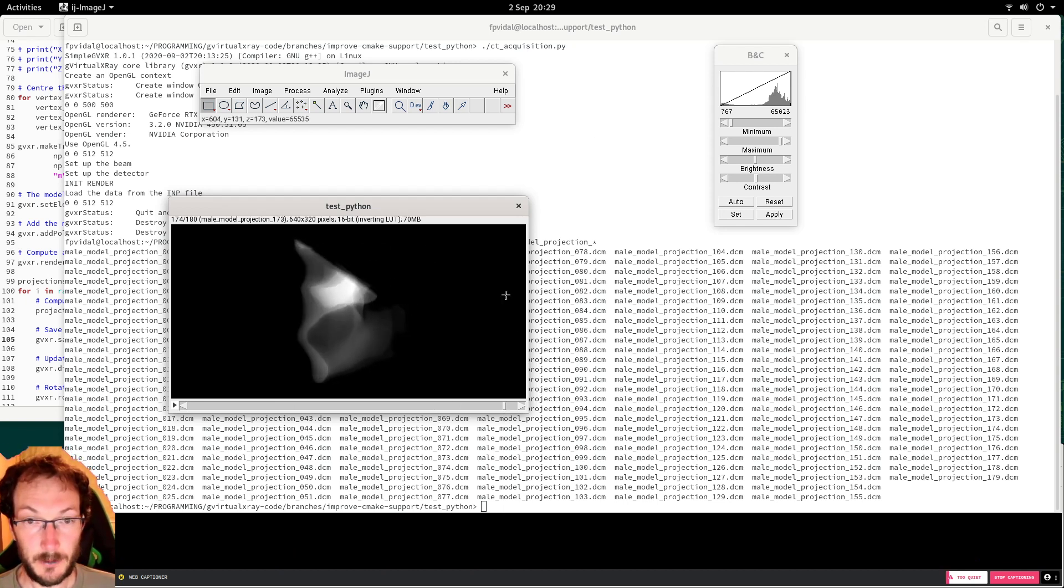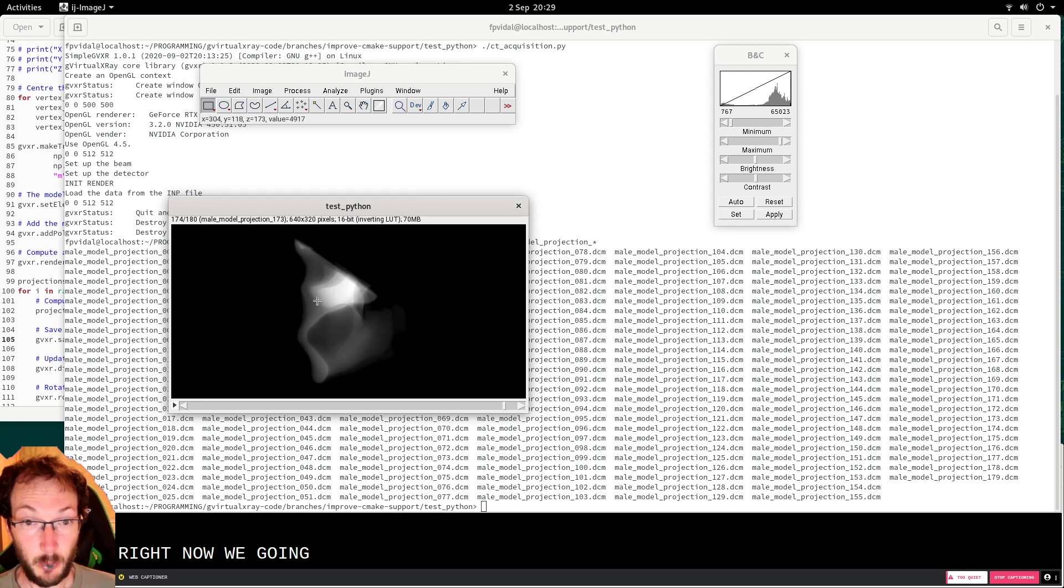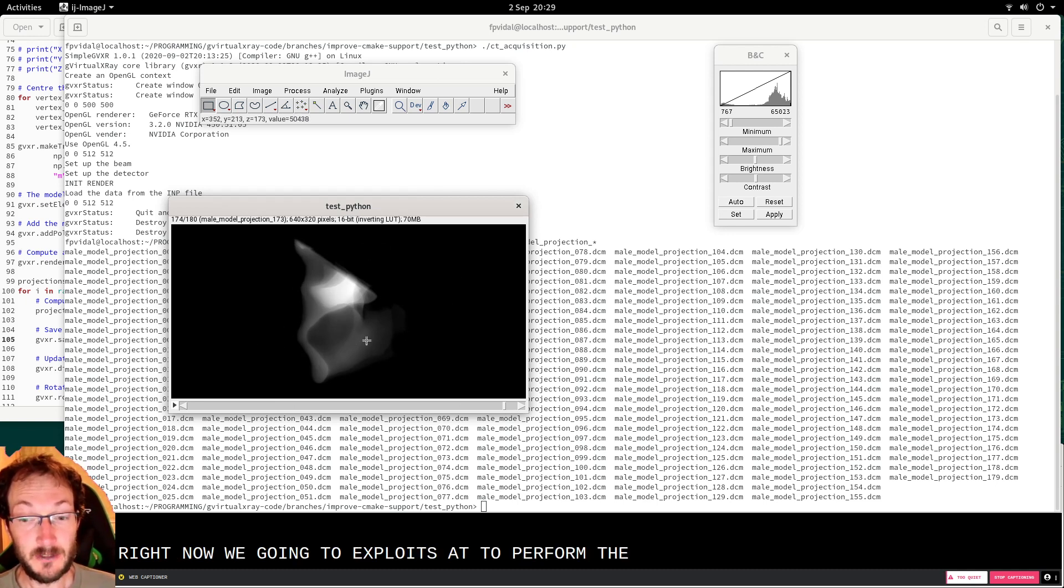Right. Now we're going to exploit that to perform the CT reconstruction.